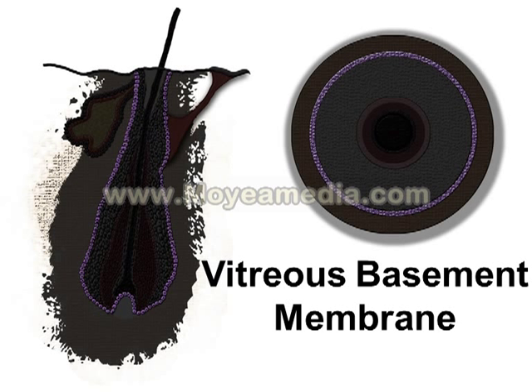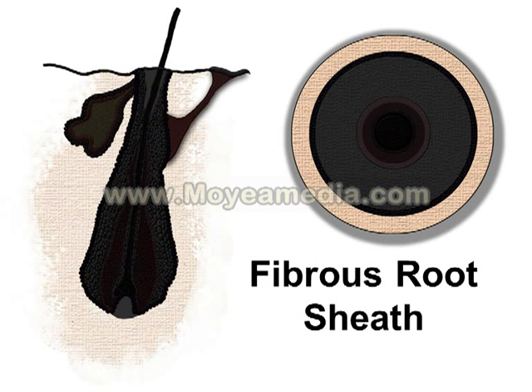Surrounding that is a glassy, eosinophilic, vitreous basement membrane zone. And following that, the fibrous root sheath, or fibrous hair sheath, which is composed of fine collagen bundles and concentric fibroblasts.